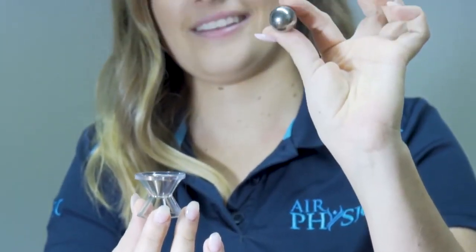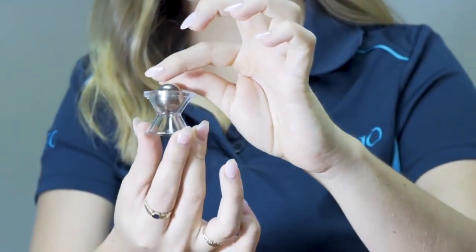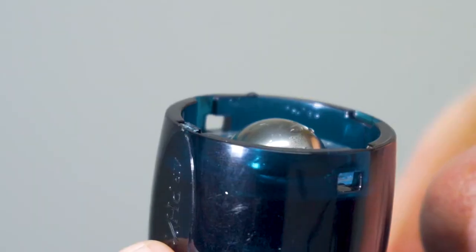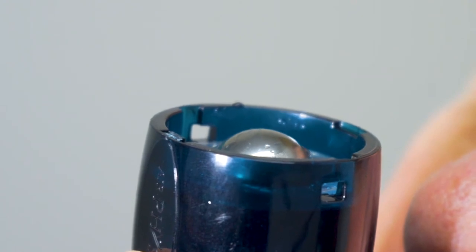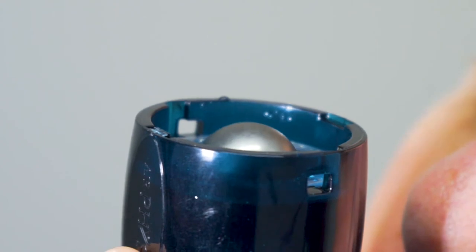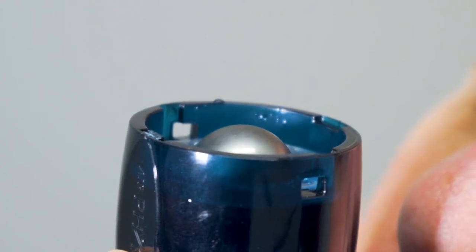Air Physio works similar in that the device has a stainless steel ball bearing which sits inside of the cone in the device. This creates an airtight seal. As your diaphragm expands when you blow out, it builds pressure in your lungs until it reaches a specific pressure which then lifts the stainless steel ball bearing off the cone.